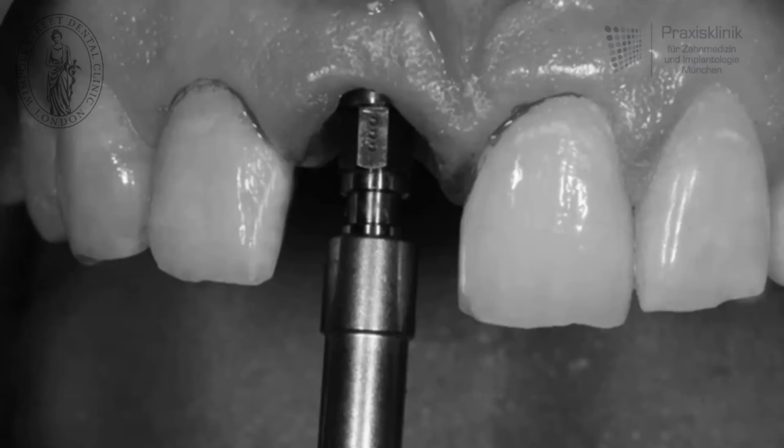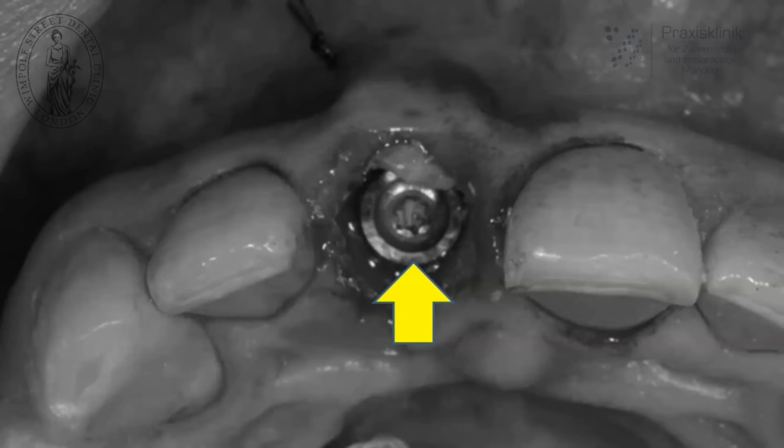And this surgery normally does not take longer than 20 to 30 minutes, but the precision is very important. You can see here the implant placed in the correct position, indicated by the yellow arrow. You can see a small soft tissue graft, indicated by the blue arrow. This soft tissue graft gives you a little more thickness and a little bit more protection in the face of bone resorption.